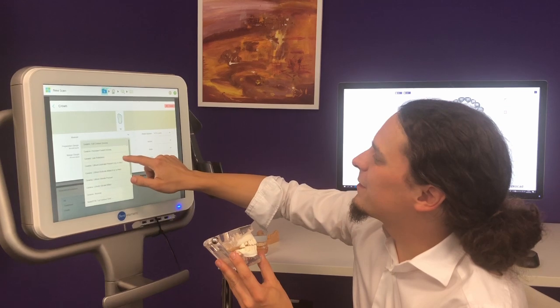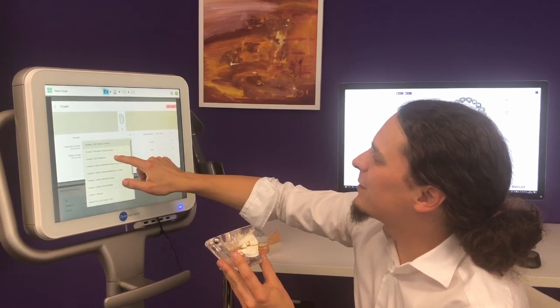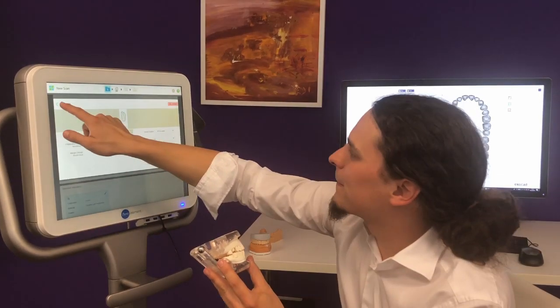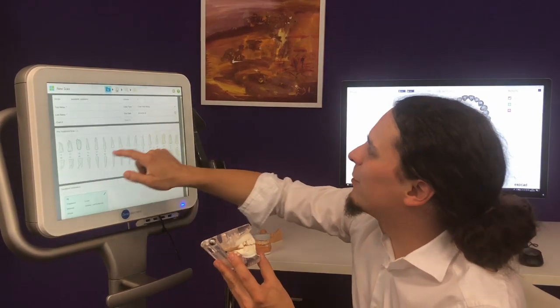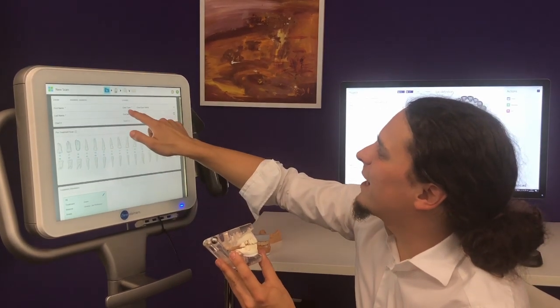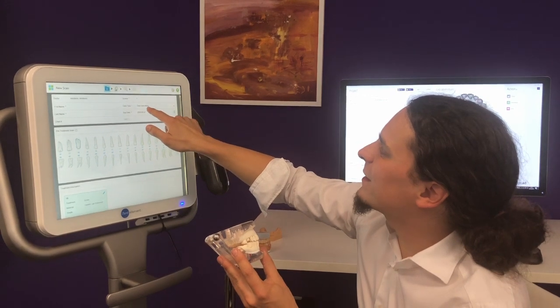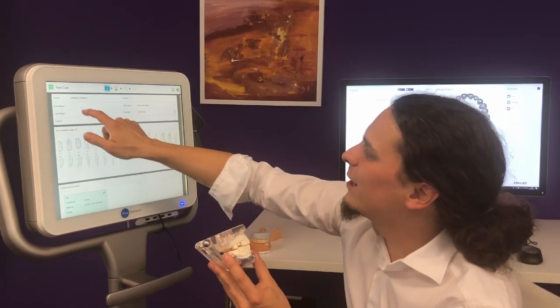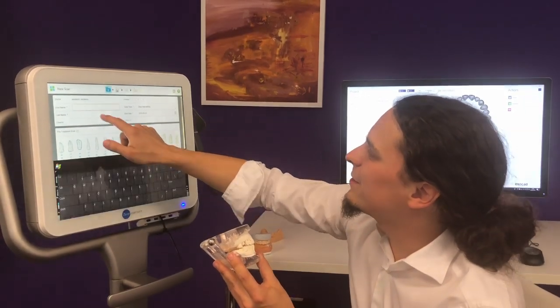We choose a ceramic material and make sure that the case type is correctly set to chairside milling, and we type in the patient name.